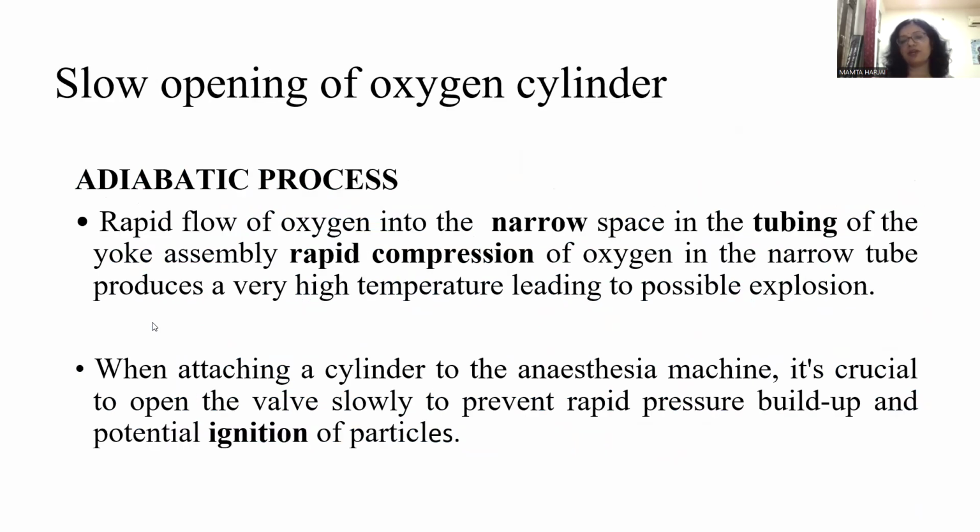As anesthetists, we should learn about the adiabatic process while opening the oxygen cylinders. We should always open oxygen cylinders slowly, not rapidly, because whenever we open the cylinder rapidly while attaching it to the anesthesia machine, this rapid flow of gas into the narrow space goes into the yoke assembly, and that is a narrow tubing. It will cause rapid recompression of oxygen in that narrow tube, producing a very high temperature because of the adiabatic process. And if there are a lot of gases or dust particles there, there is a possibility of explosion. So it is crucial that we open the valve slowly to prevent the rapid buildup of pressure and prevent ignition of particles.